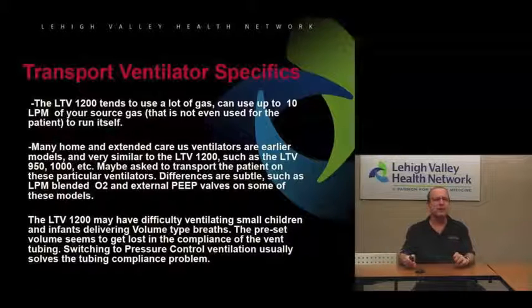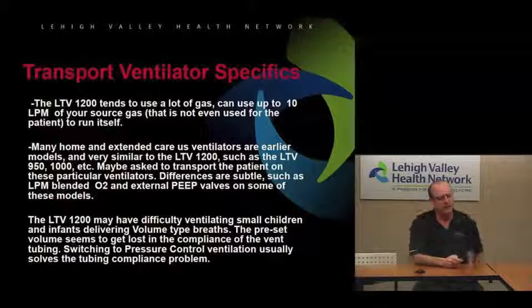And they operate very similar. If you have these patients and they're already on it and they're tolerating it well, especially if they're going back to a non-acute care setting, by all means, take them back on this. They'll probably be more comfortable. The family will be more comfortable if you just use that ventilator. And they might actually be on that ventilator while they're in our ICU or even our PICU.